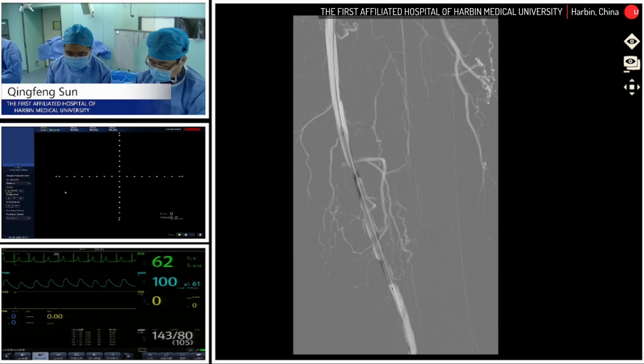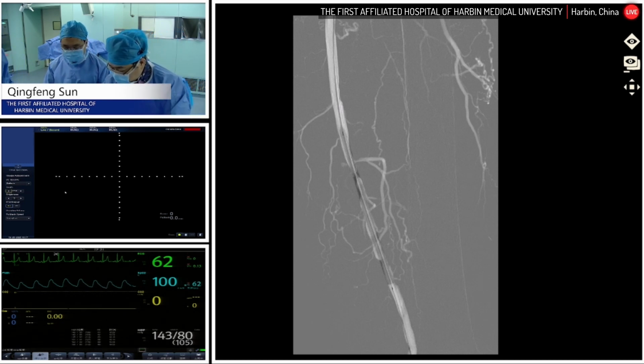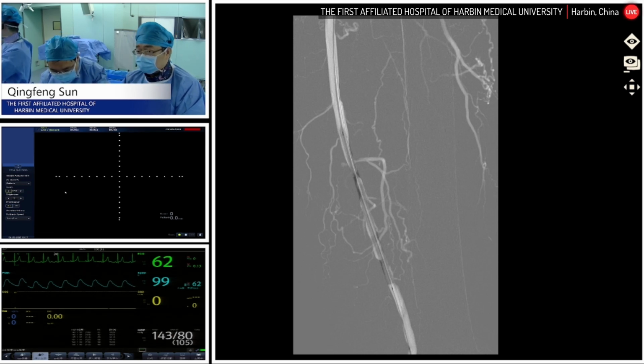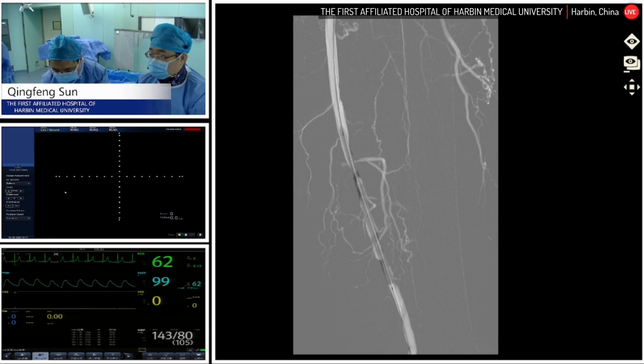Yes, indeed. On the slide we show, Dr. Gong, can you show me the last slide, the cross section for the CTA? Can we see the PPT right now?